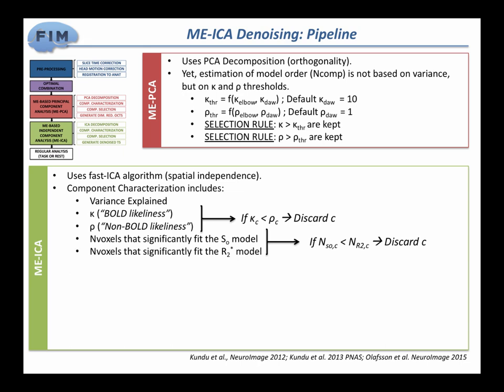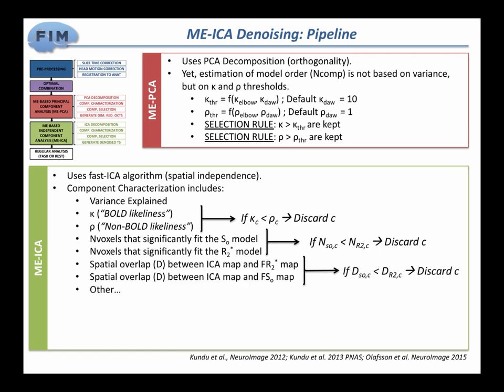It's going to look at the number of voxels that follow the linear trend versus not, how well they are compacted in space or not, a lot of things like that, and a long list that I'm not going to go through because some of them keep changing.